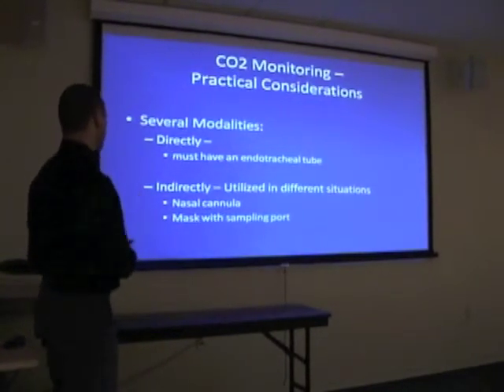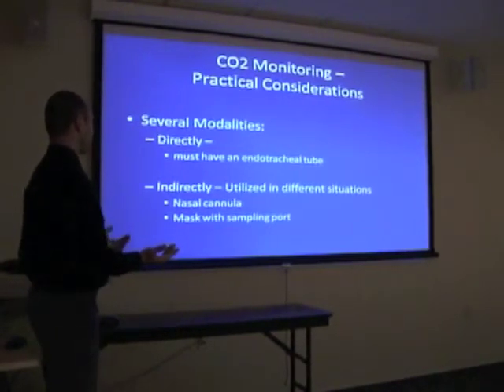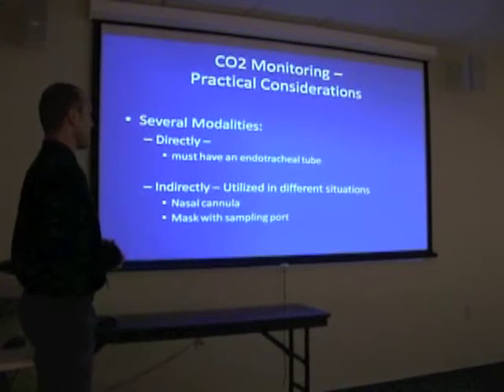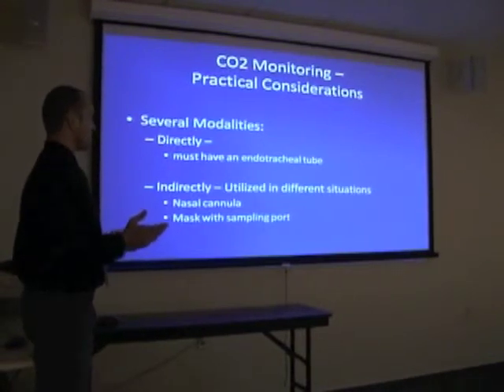So really, the practical consideration. How are we going to measure this? That's really what this comes down to: in what way can we really utilize end-tidal CO2 or capnography in your practice? And really, there's two ways to measure end-tidal CO2.